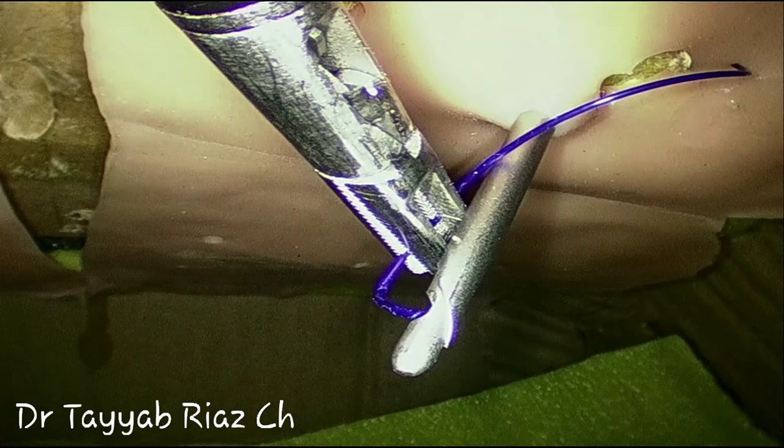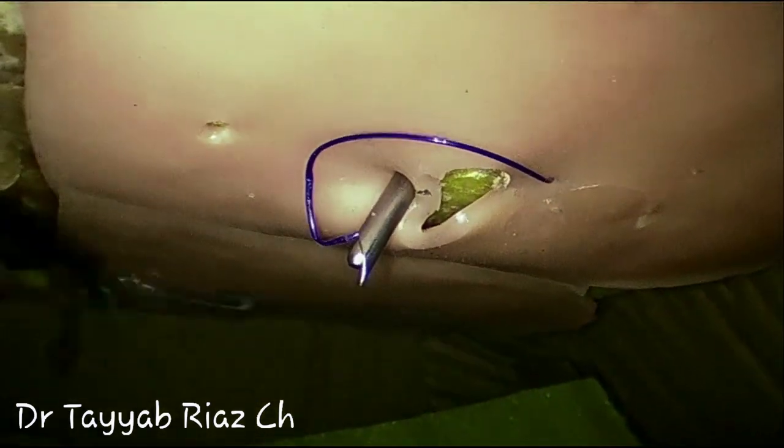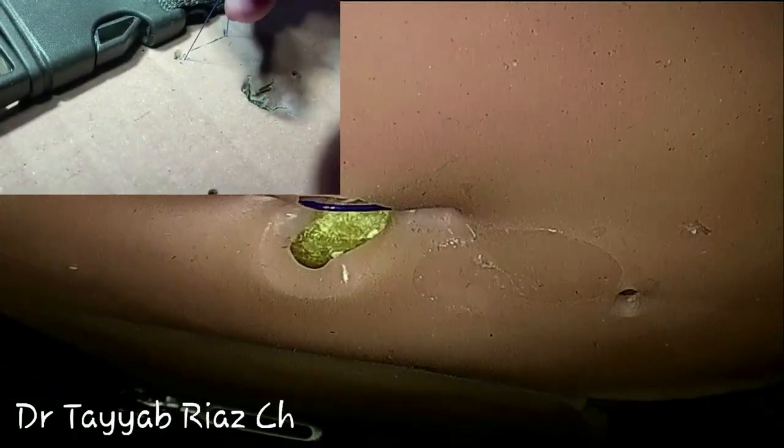After that, pull the stylet and bring out the end of the thread and make the extracorporeal knot, and this knot will be buried in that 10 mm incision and that will be closed afterwards.